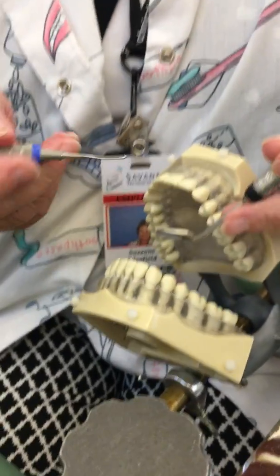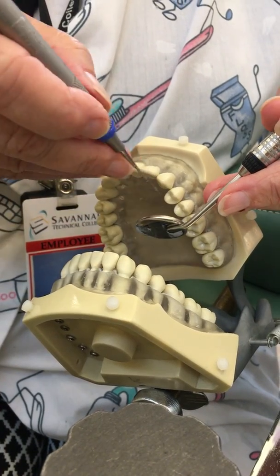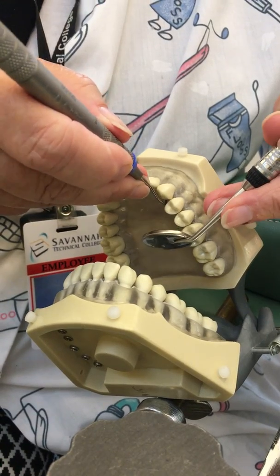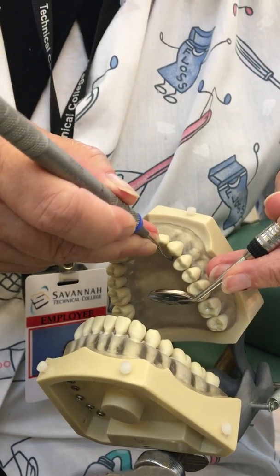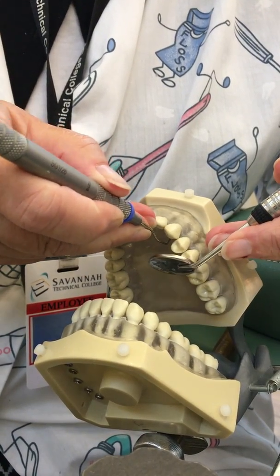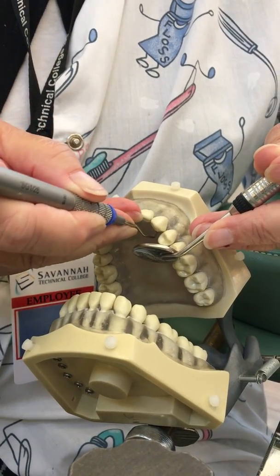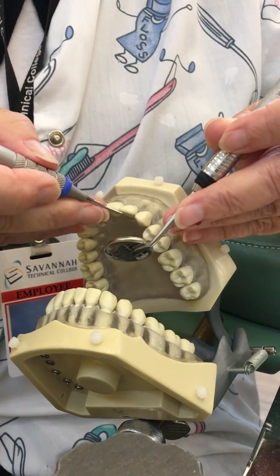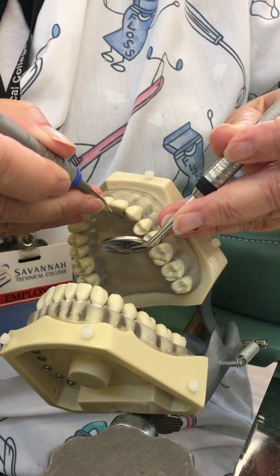Now I'm going to come back in the opposite direction and turn my toe in the opposite direction — if it's wrong in one, it's right in two. Going toward the tooth to close, insert, explore, then open to activate my stroke, which is my cutting stroke. I apply lateral pressure on the coronal part of my stroke but not the apical, so that I don't shove anything down into the base of the sulcus.